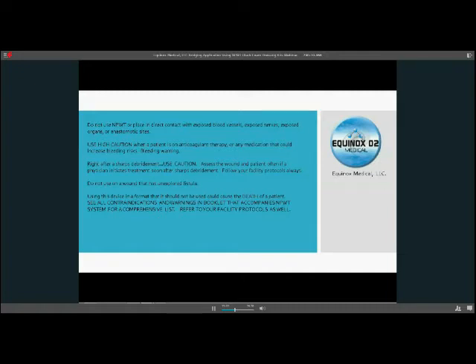I always put down that you want to use high caution. Many patients are on anticoagulant therapy. So they could be on Coumadin, they could be on heparin. And it's not that you can't use it, it's that you have to be very careful. A lot of different medications have an anticoagulant property. So you want to make sure, because this will put your patient at a higher bleeding risk. So you want to take caution there.